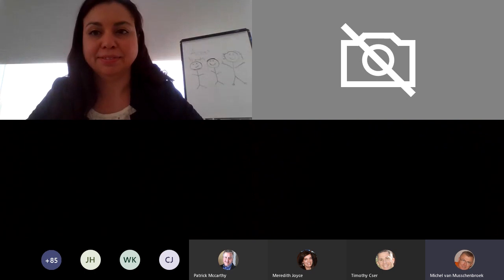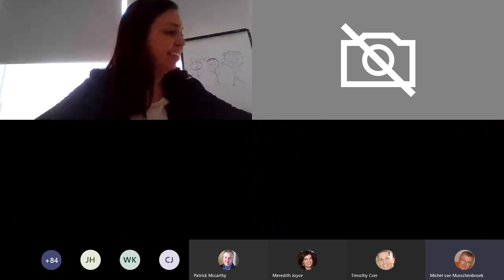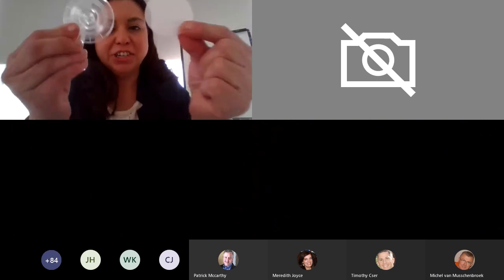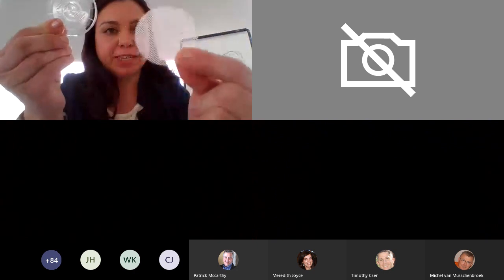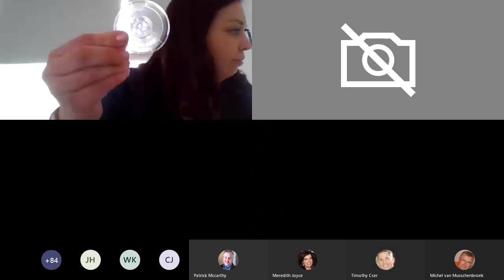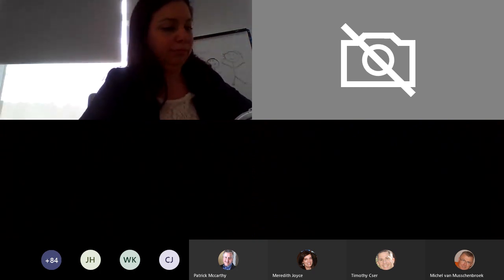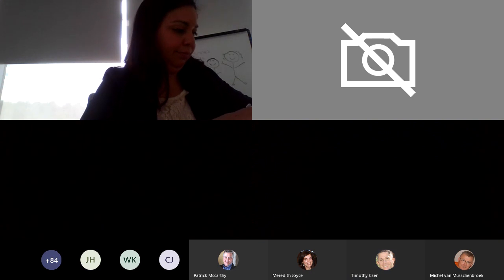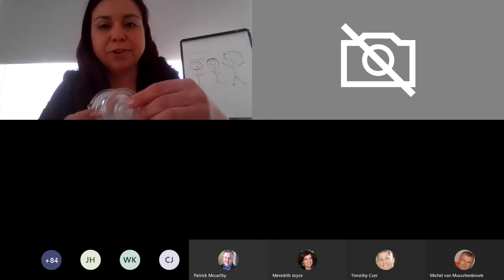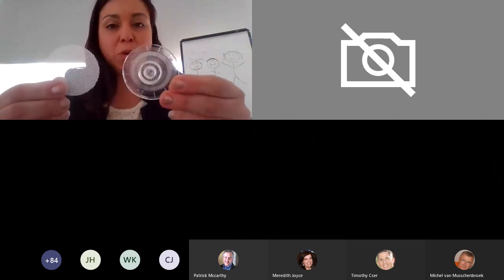There's a question about the spacer — why isn't it needed? It's no longer needed. These are our two spacers: the old spacer, which was basically just a mesh spacer, and the new spacer that comes on the bottom of the filtration unit. This is the part that gets left behind — it's a spacer and a drain kind of built into one.